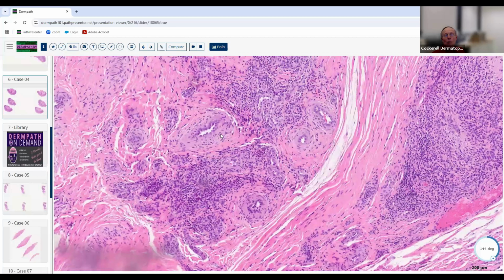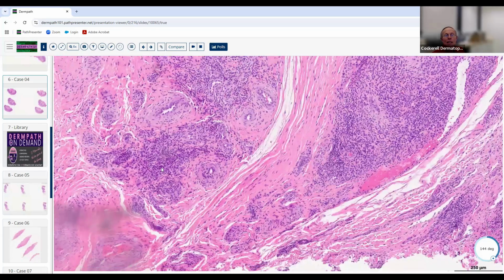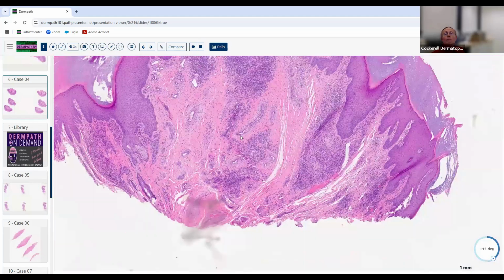In fact, you can make the diagnosis without getting very much inflammatory infiltrate if you see a lot of these blood vessels like this. So that's one thing I really want you to focus on: recognizing these very, very large plump endothelial cells with the very thick walls around them. That's classic for this entity. And then when they have the lymphocytes and the EOs, well, then you're home free, like you made the diagnosis.